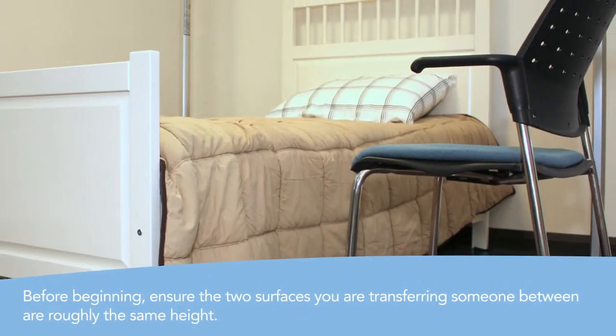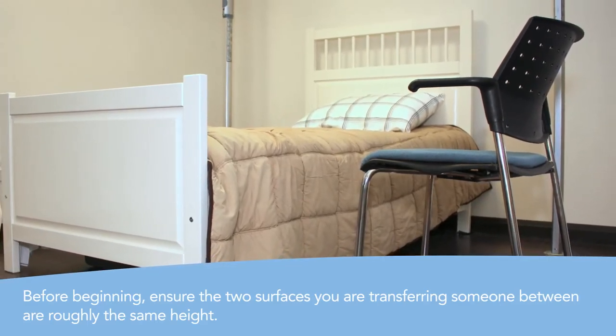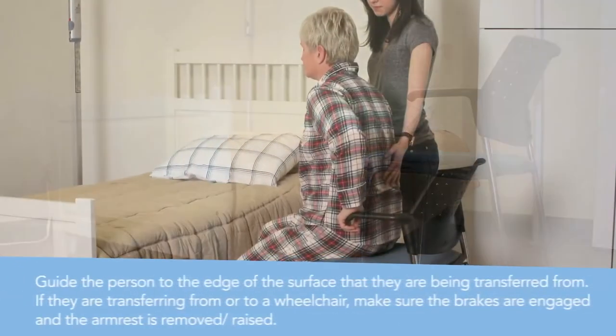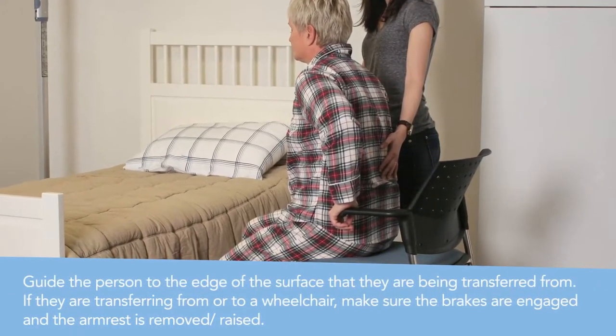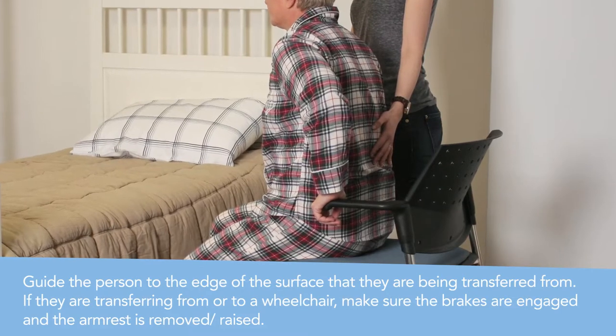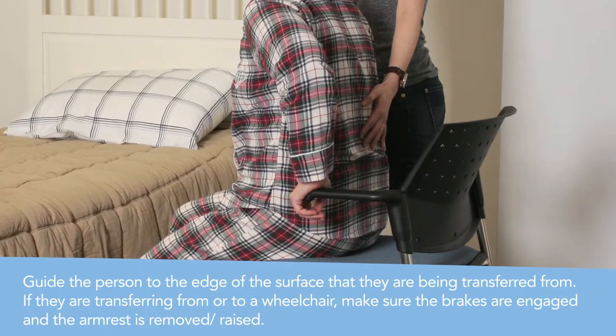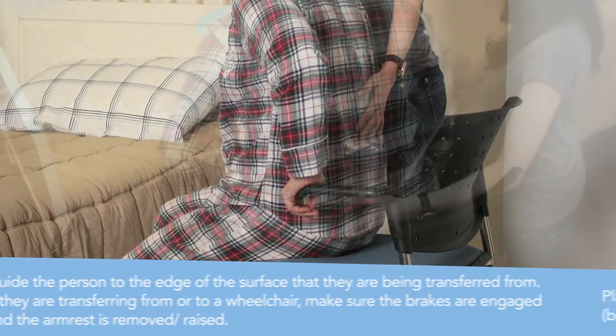Before beginning, ensure that the two surfaces you are transferring the person between are roughly the same height. Next, help the person you are transferring shift to the edge of the surface they are moving from. If they are transferring from or to a wheelchair, make sure that the brakes are engaged and that the armrests have been removed or raised.